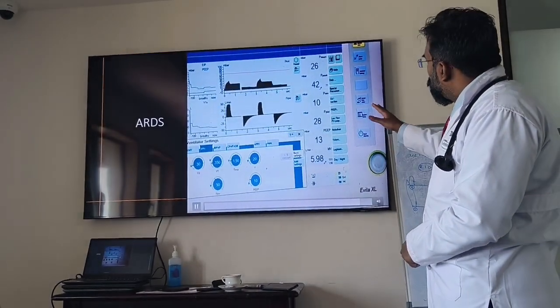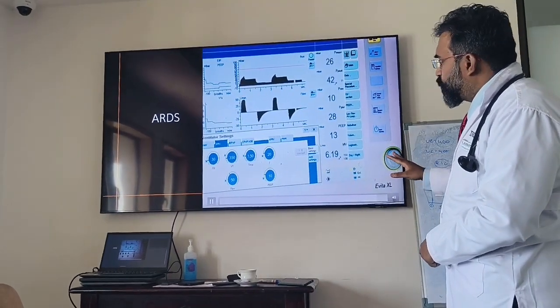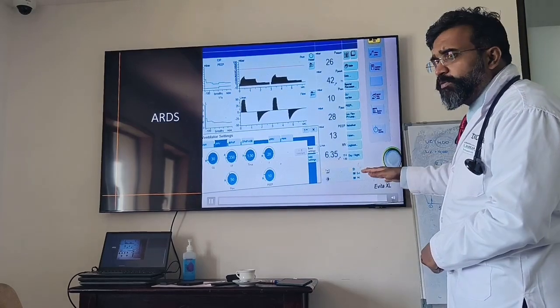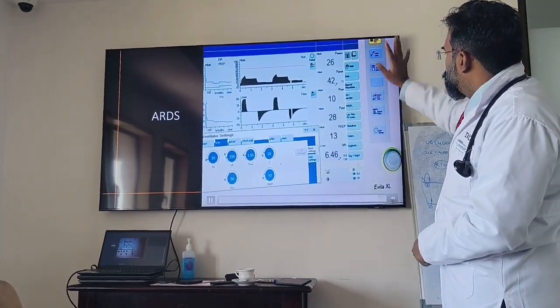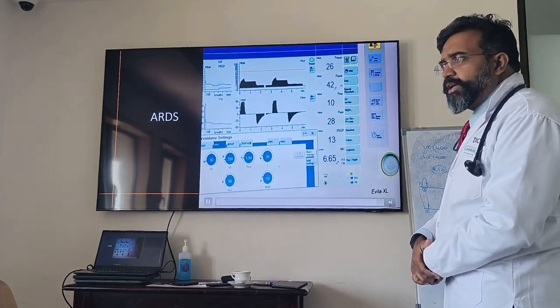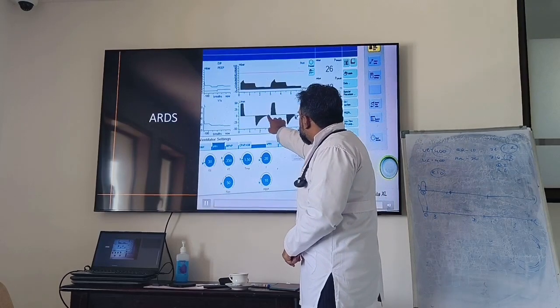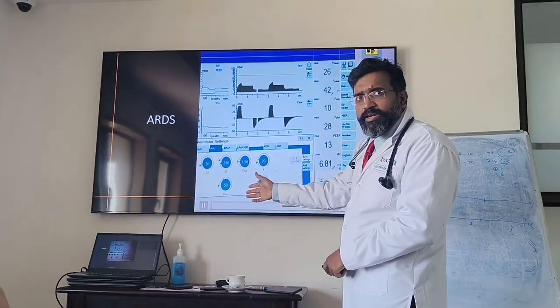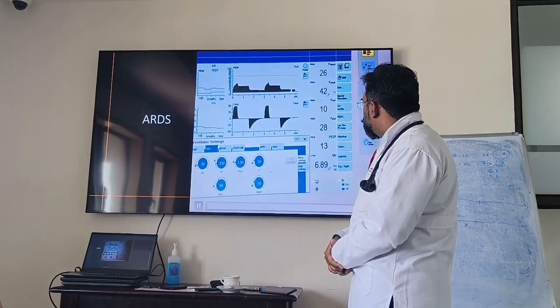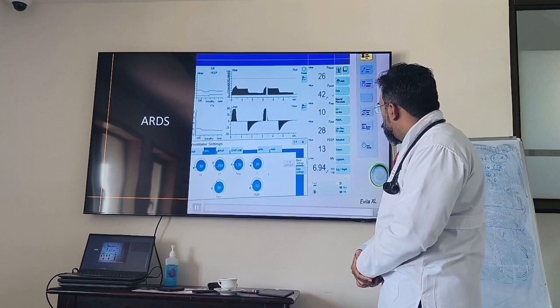Now I feel that okay, my plateau pressure has come to 28, my minute ventilation is more than 6 liters, I got an inspiratory expiratory ratio that is comfortable for me, my plateaus are okay, my mean pressures are 26. So now it looks kind of okay. At the moment plateau pressures are fine. I don't see flow restriction on my expiratory flow waveform which I was seeing a while ago. And my minute ventilation has gone up after getting my RR.